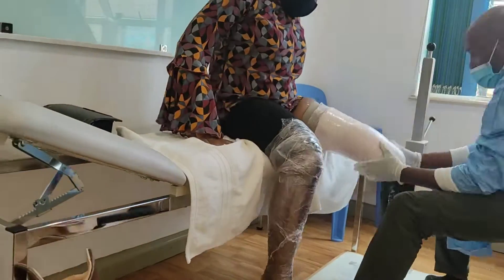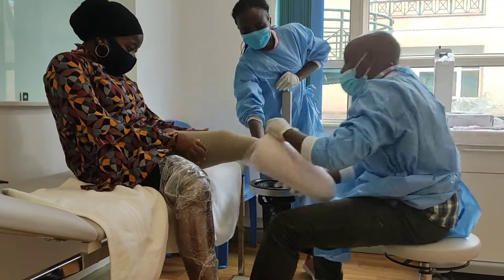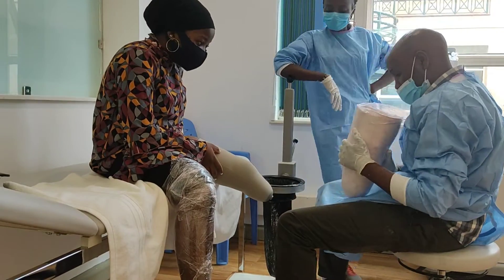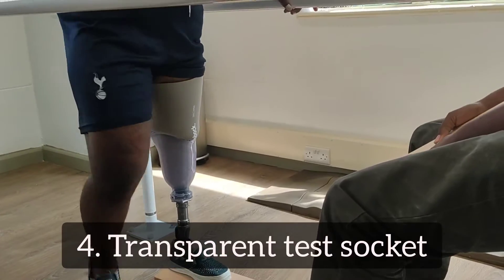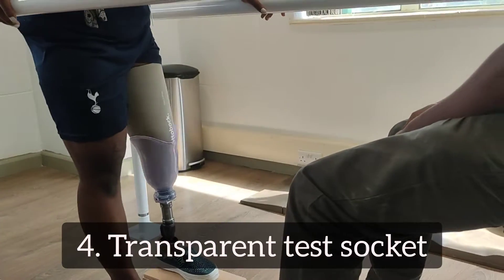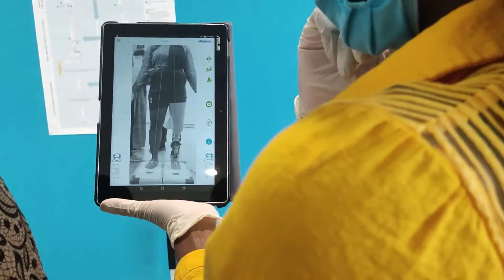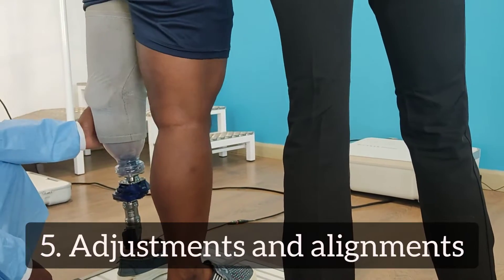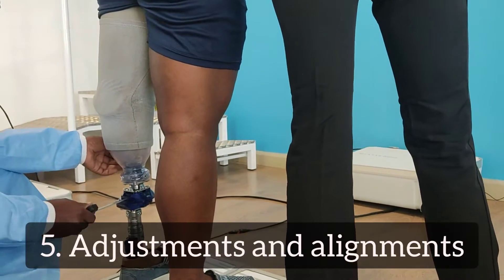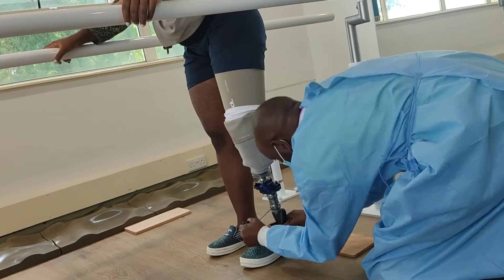Now the cast is ready! That means they can start making my prosthesis design and start making my socket. This cast is going to be used to make my transparent test socket, and it's made from this oven. Here I am wearing my test socket — this test socket is to ensure that the prosthetist can make adjustments and alignment where necessary.